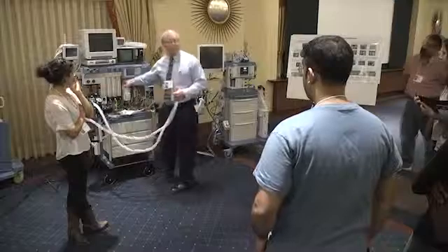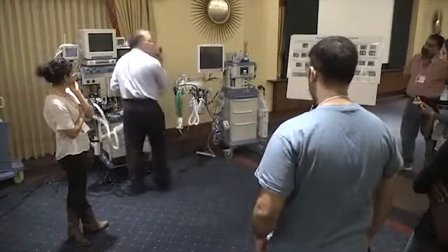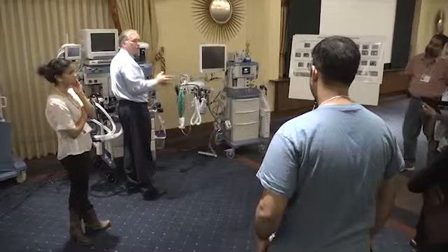And then at the time that this is open, go to the other vaporizers and see if they open to check out the exclusion system, because they should not open. As soon as you close this guy up, open this one and test the other two that they don't open, and so on and so forth.